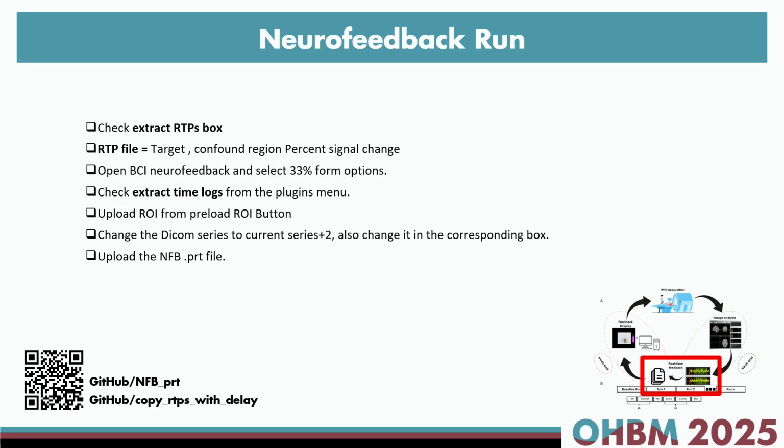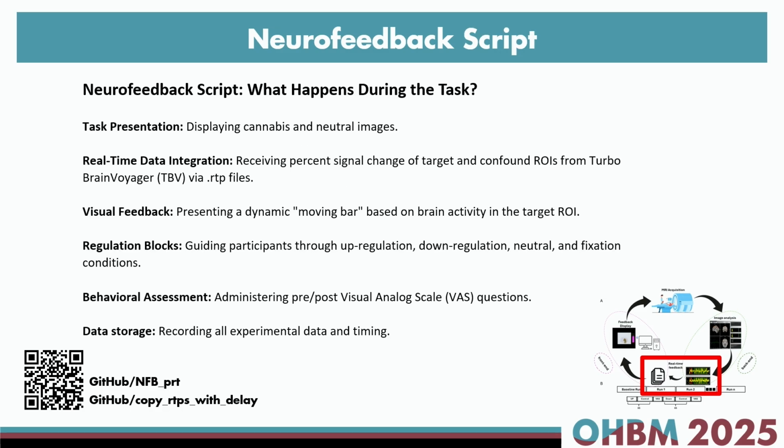Don't forget to upload your ROI. Again, it is important. If you don't define the ROI, you won't receive the data from your ROI. So all of these are important, and the protocol timing file as well, which is so important.